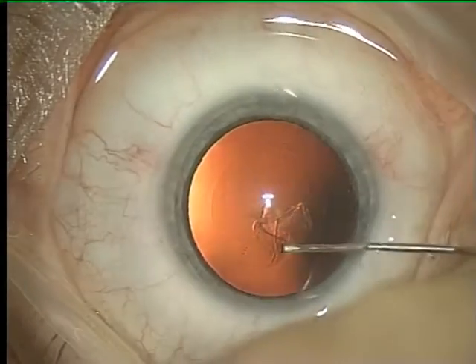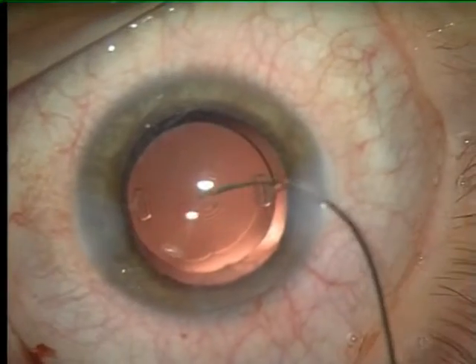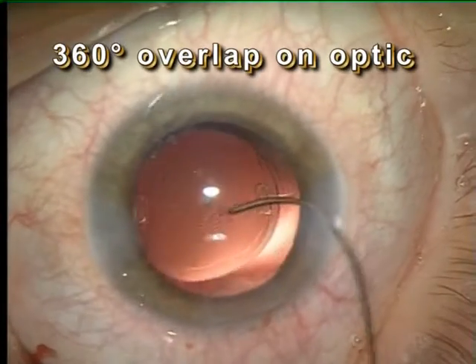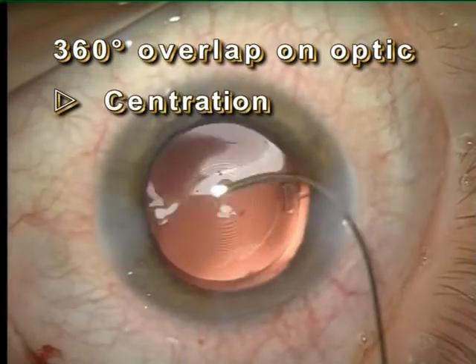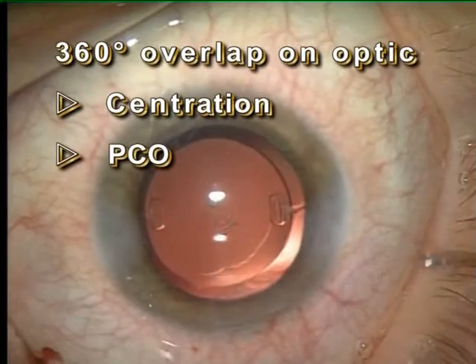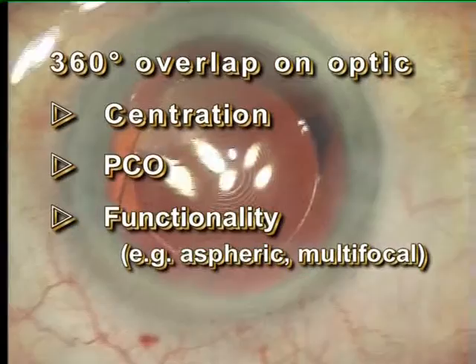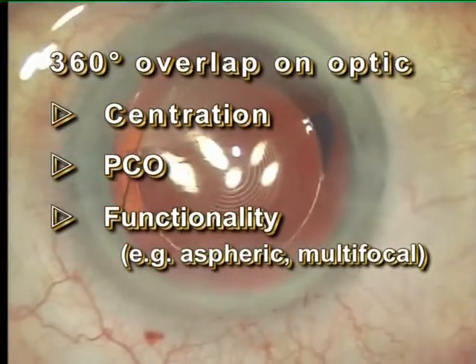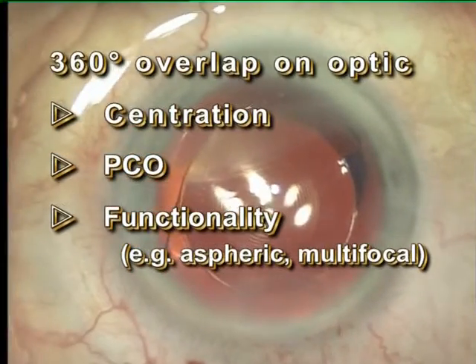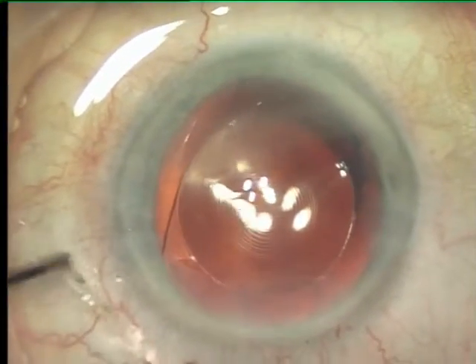A slight 360-degree overlap of the CCC on the IOL optic facilitates IOL centration, reduces PCO development and edge glare. The CCC size plays a central role due to the emergence of new IOL technologies.